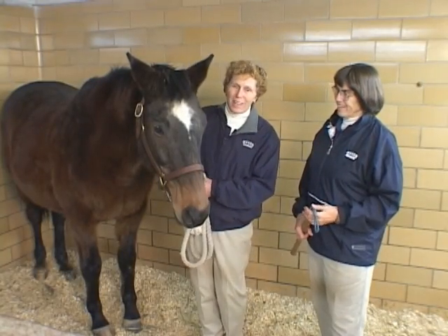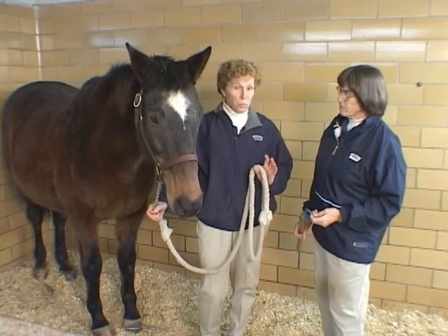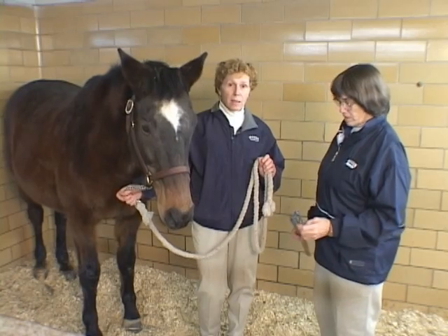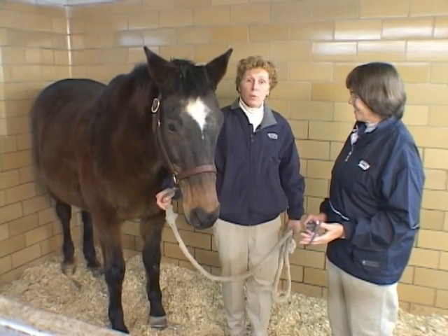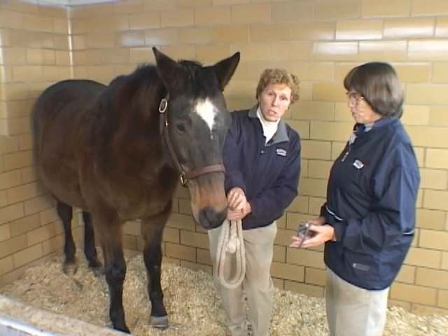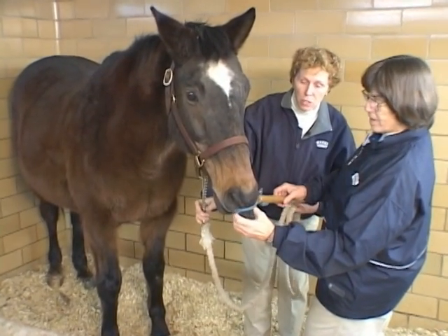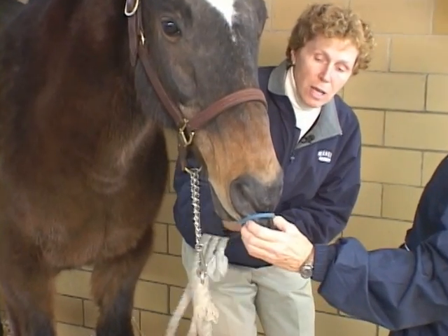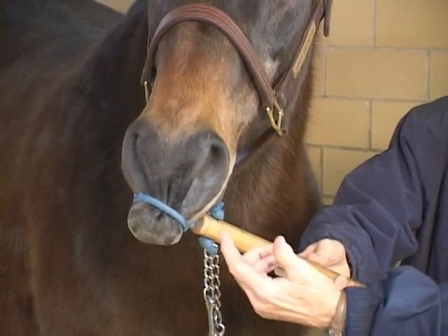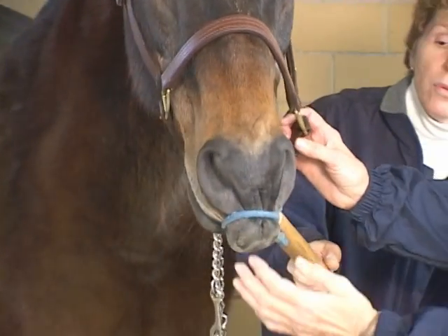Leroy was such a good patient and didn't really need much restraint, but we need to talk a little more about restraint when tubing a horse. Lots of practitioners will routinely twitch every horse that they tube. One of the things you can do as a tech to make everybody look better and make it go better is to be aware of the direction in which you twist the twitch, because the direction you take the loop is going to dictate which side of the nose is more open. If I twist it clockwise, I am twisting it away from the left nostril and making the left nostril larger than the right — so I'm giving Dr. Hamill a better target. That's certainly one of the things you can do with the twitch when restraining.